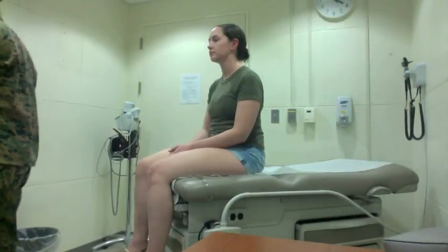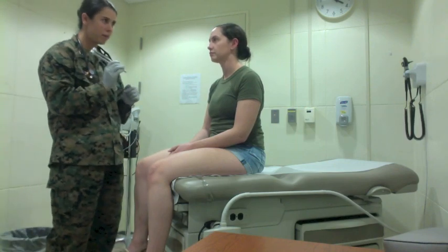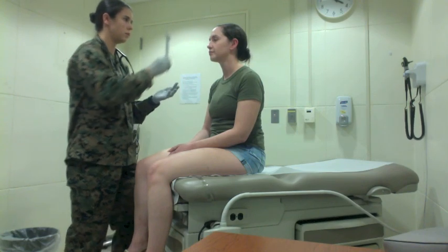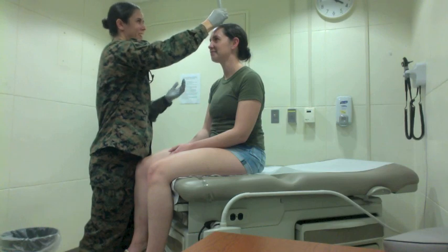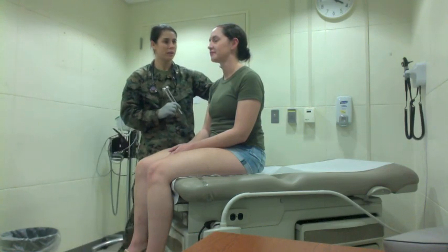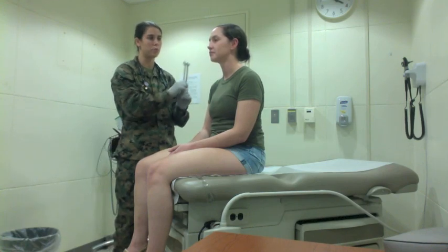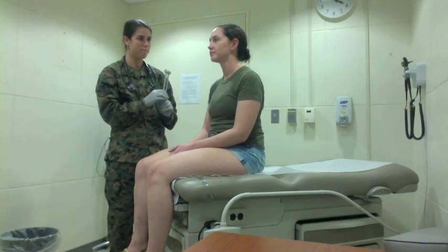And then I'm going to test the hearing with this tuning fork. I'm going to place this on the top of your head. Let me know if you hear the sound in both ears. Yes. Okay. And then same thing, I'm going to put the tip of this on your mastoid process, and then let me know when you stop hearing the sound, and I'm going to move it to right next to your ear, and let me know when you stop hearing it.